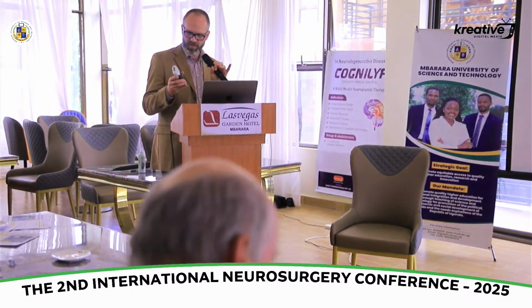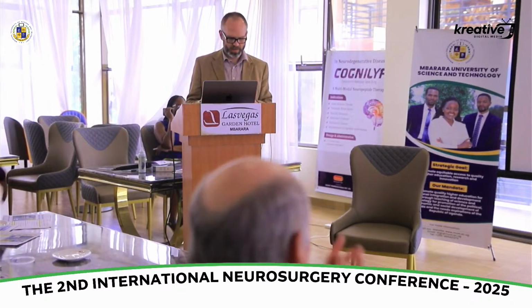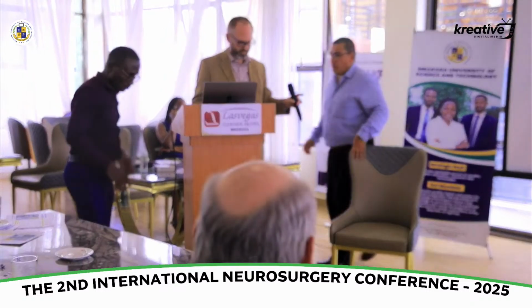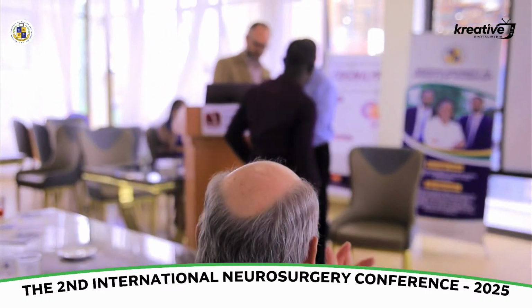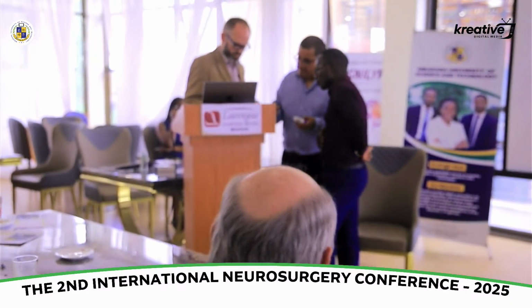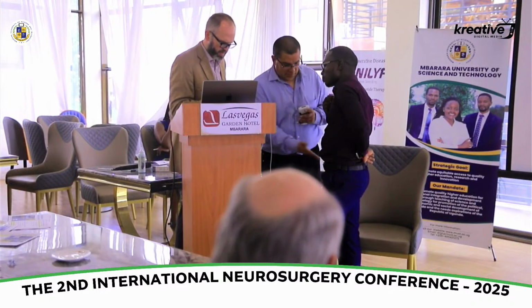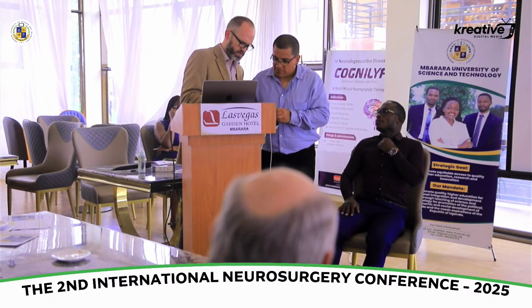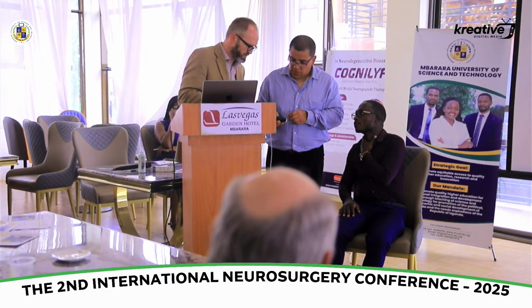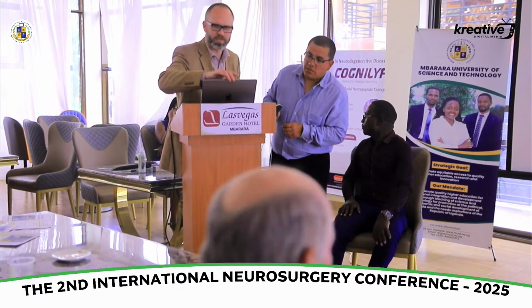So Joseph, you can come up here, take a seat. You have to control it from my phone. So the controls are from the phone. All right. So B mode, and you can do color, power Doppler, or pulse wave. Let's start with B mode. You're live right now. So you can use the button there, not the power button, but the other one, that freezes or unfreezes it. Okay. You have gel? Where did the gel go? I had a whole bunch of gel.